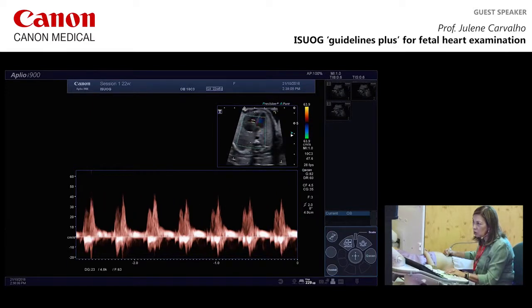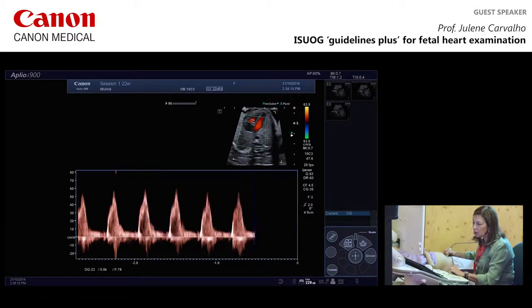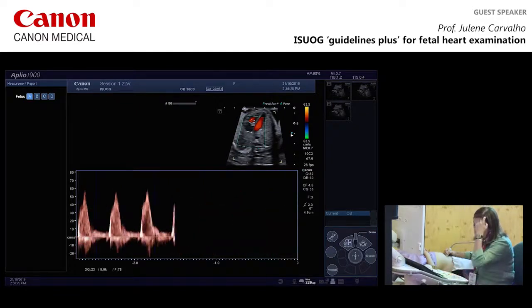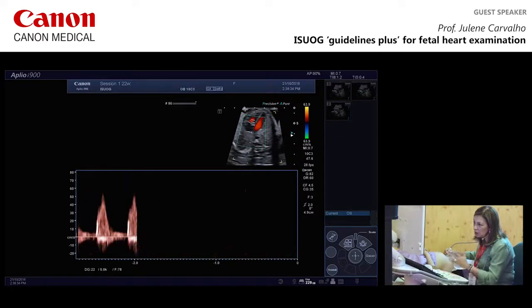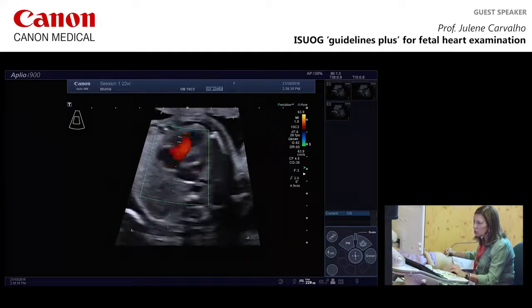So now I can move to the tricuspid valve. Velocities are usually a little bit higher in the tricuspid valve, and not infrequently you get a summation of the two waveforms. If you're going to make measurements, you really need to try and get at least 3 cycles that look more or less the same. You can see they are almost adding up here, but it's the E wave, the A wave, and it's quite stable. If it's very unstable, it's difficult to make any judgment about the velocities.